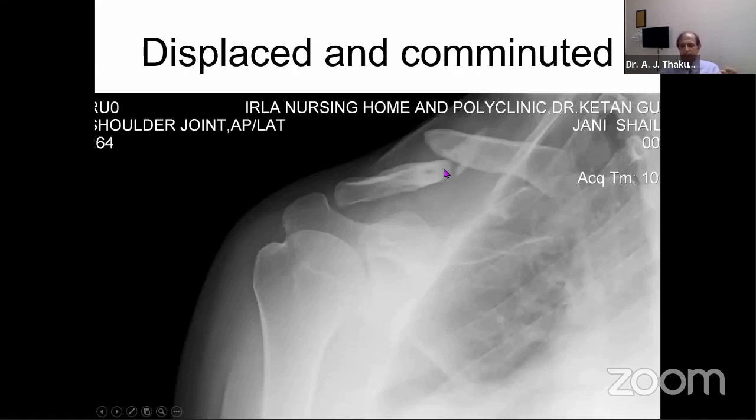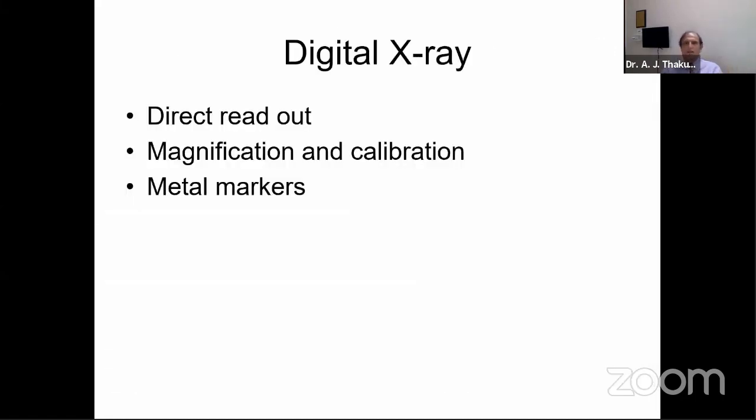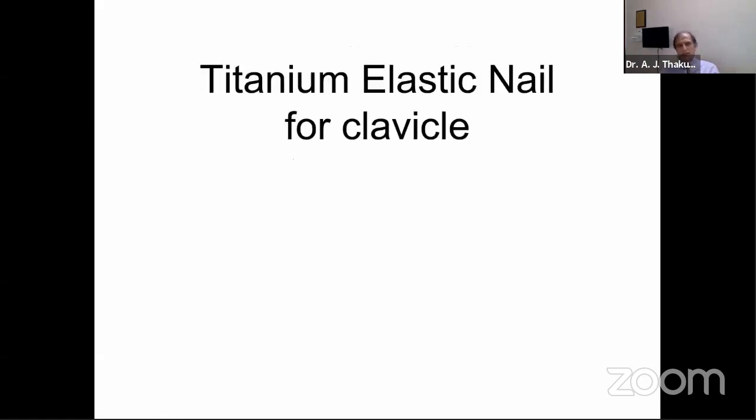On digital X-ray, it is easy to find out the displacement directly. One can measure it. I said if it's more than 2 centimeters, one should offer surgery to the patient. This patient had more and he was willing for surgery. So we did that. I resort to these titanium elastic nails.